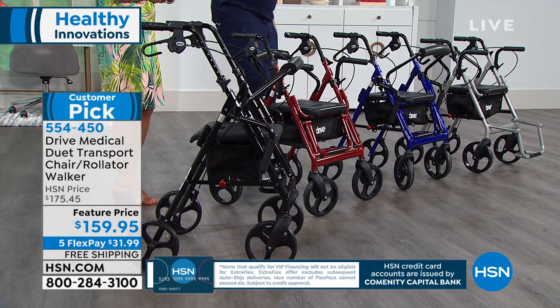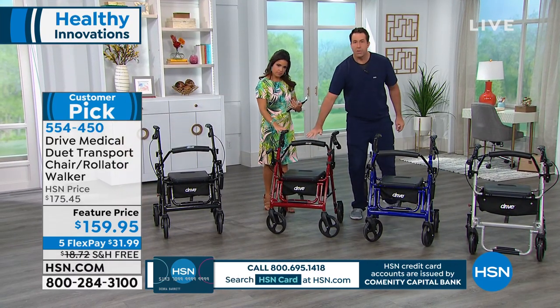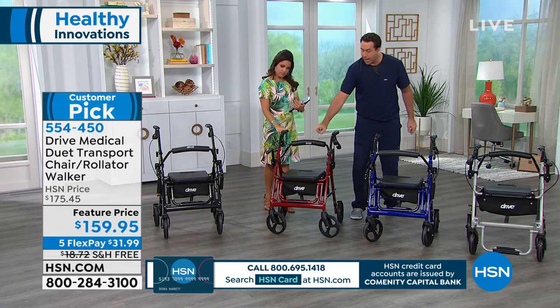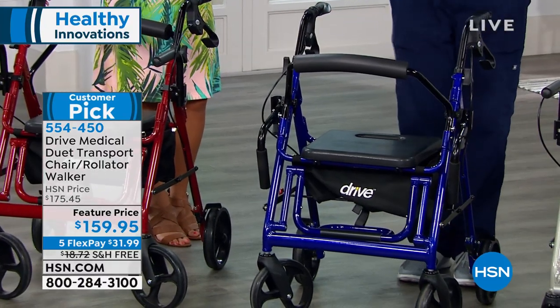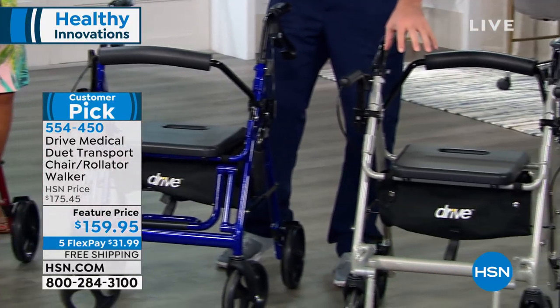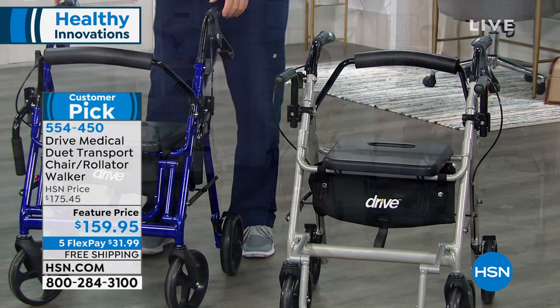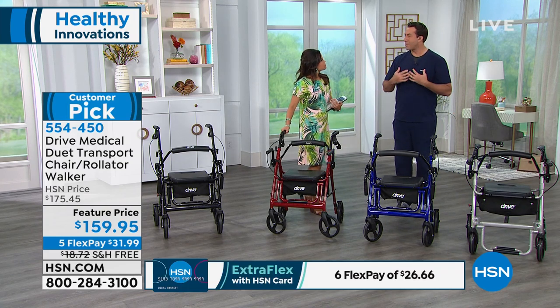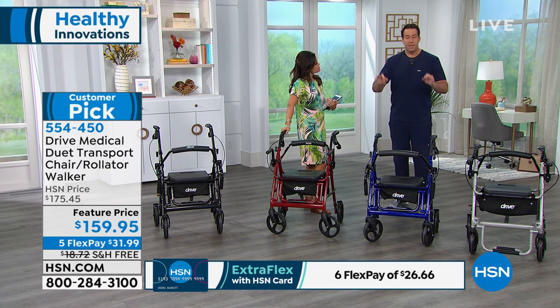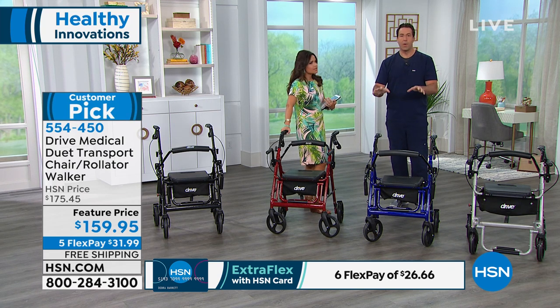In the red here we have the padded armrest and the backrest, which is reversible — over here it's flipped to the other side. Over here on the silver you have the adjustable footrest down. The height adjustments on the ergonomic handrails are all in slightly different positions, because whether you're 6'3" like me or you're 5'2", this is going to accommodate you anywhere in between with those eight height adjustment levels.